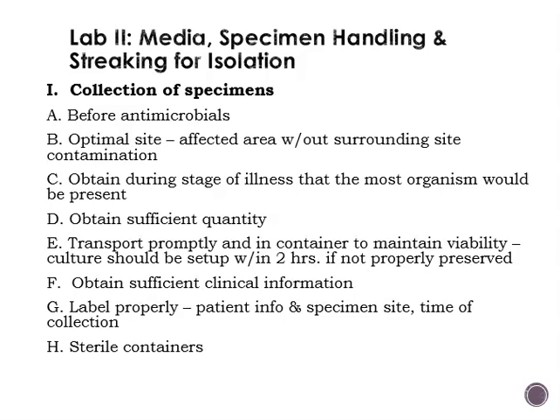And then the time of collection, that's always important, that's notated on the specimen container. If a clinical specimen comes into the lab and it does not have the site listed on it, you need to call and find out. Call the nurse that collected the sample, call the doctor, whoever you need to get in touch with to find out the site, because not only is it important in determining how we determine pathogen versus normal flora, but also what plates that we set the culture up on.